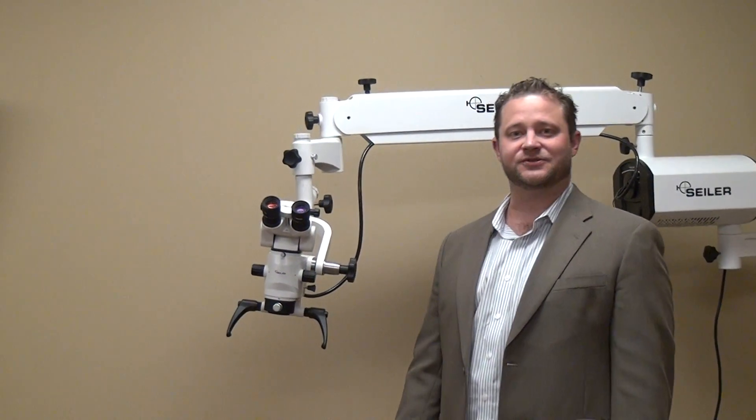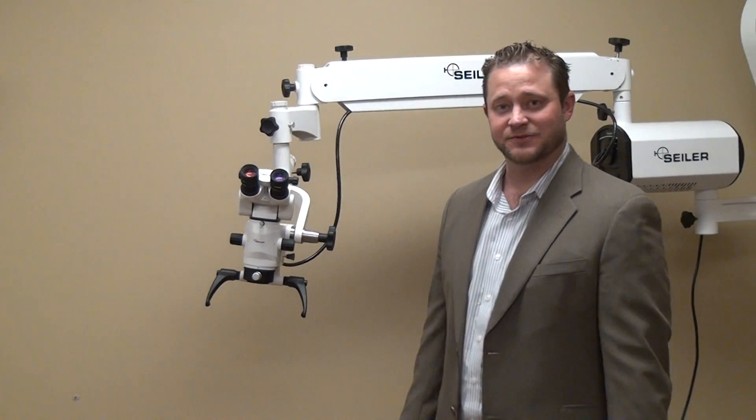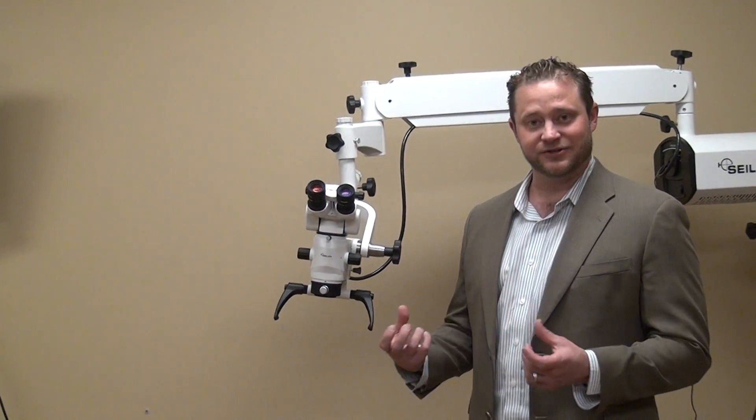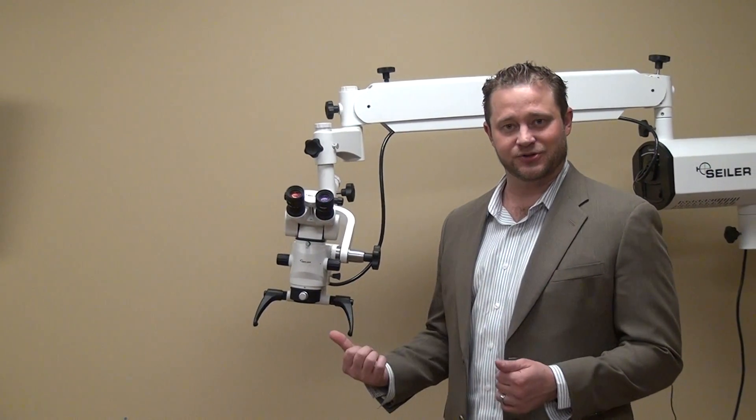Hi, Dane Carlson here, Division Manager of Seiler Microscopes, based in St. Louis, Missouri. Today I want to show you how to assemble a digital camera onto a surgical microscope.